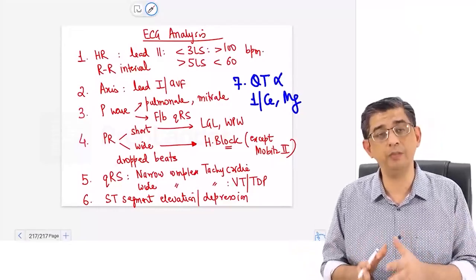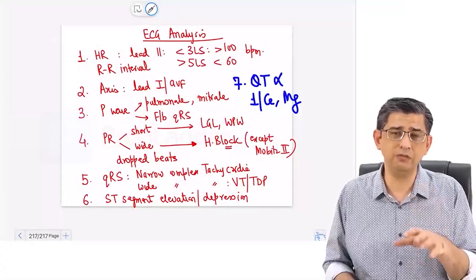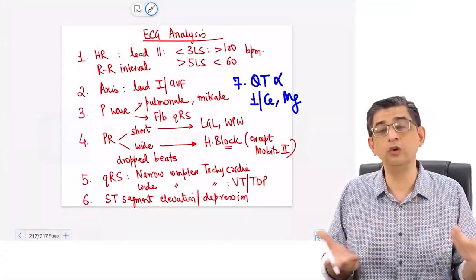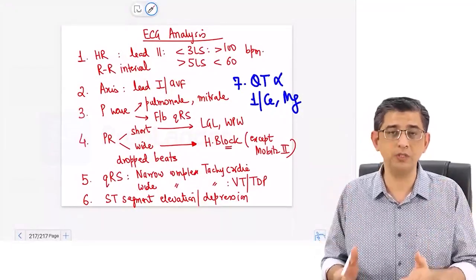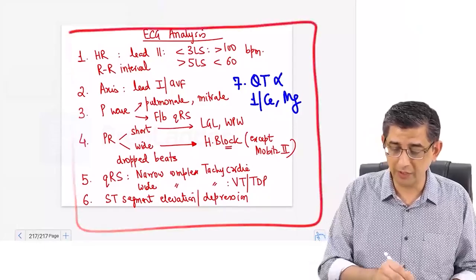So it comes with practice, guys, because when you see the same thing again and again, then you get used to it. When you see something very occasionally, maybe once in a month you see 1 ECG, you won't make any sense of it. When you start seeing 5 every day, then something will start making sense gradually in your interpretation skills. So my humble request to you, guys, is please try to deploy it in the second read and in the first read.